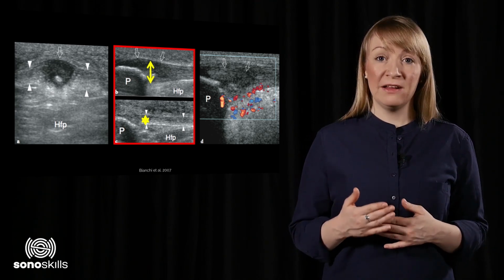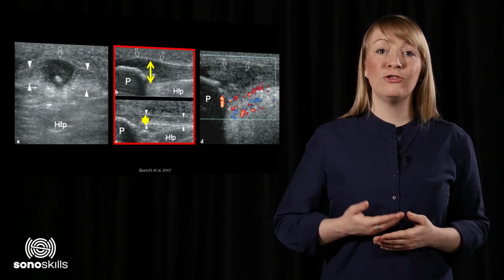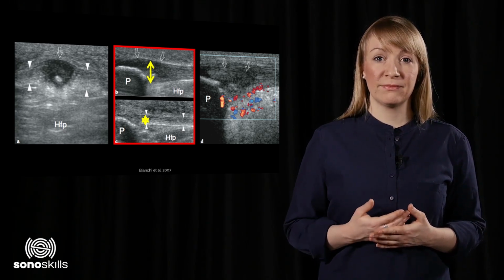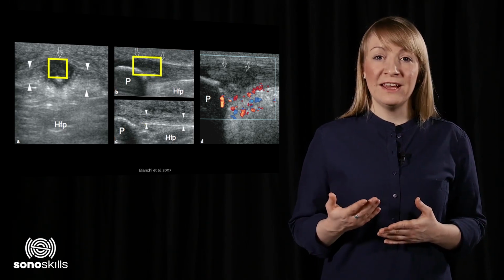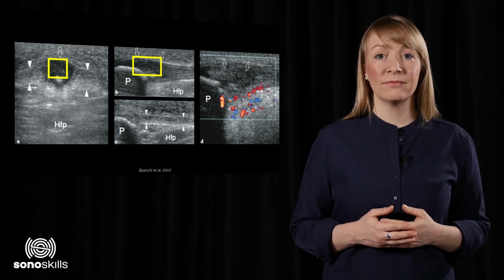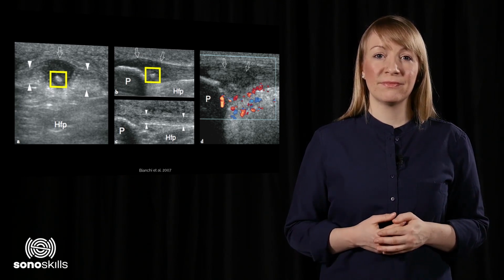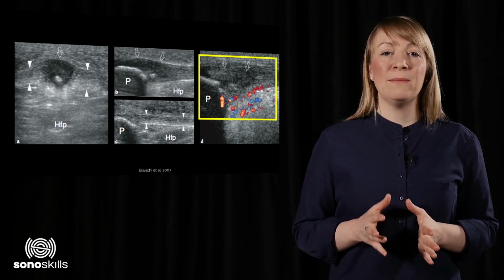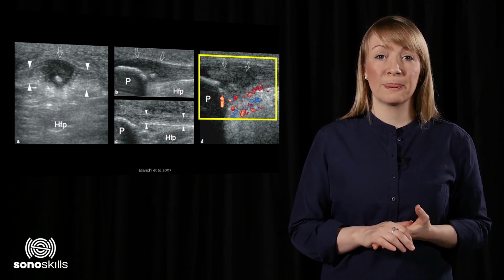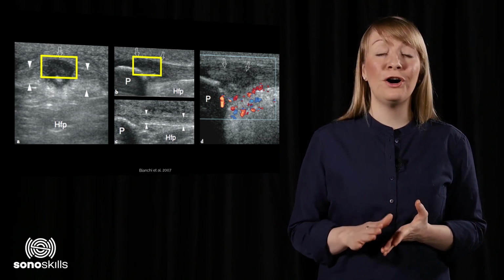The upper image in the middle of this slide shows the pathology site. When sweeping the transducer towards medial and lateral, the same ligament appears to be healthy. The echogenicity has changed. Parts of the patellar tendon have turned hypoechoic, but some parts have turned hyperechoic. Colour Doppler imaging shows local hyperemia around the deep tendon surface. Some parts of the tendon look really dark, and small partial tearing can't be ruled out.